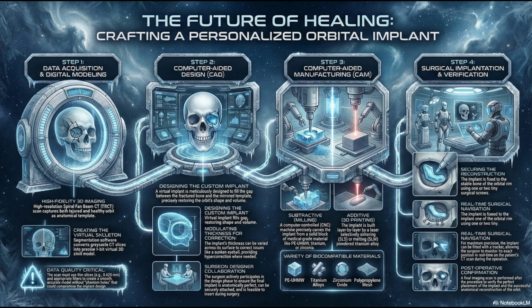Now, on the other hand, you have zirconium oxide or milled titanium. They're rigid, they're highly radiopaque, so you get great post-op imaging, but you absolutely cannot adjust them in surgery. Which means the digital design has to be flawless from the very beginning. Flawless. For zirconium, you even have to build in a 20% enlargement in the CAD file to account for the material shrinking when it's sintered. My point is, balancing that need for surgical flexibility against the need for post-op assessment, it's a series of complex engineering decisions that happen long after the CT scan is done.